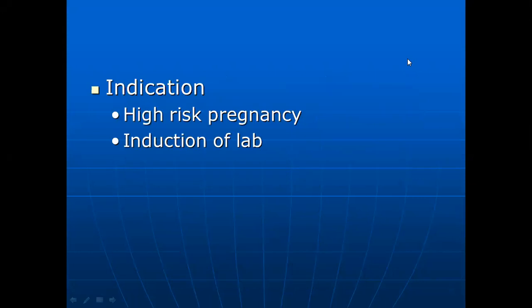What's the indication of this test? We need to do this test in cases of high-risk pregnancy like post-date and post-term, a patient with diabetes, gestational diabetes, in presence of preeclampsia or in presence of PROM, or before induction of labor to show if the fetus can withstand the contraction or not.